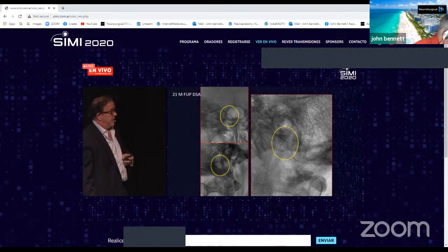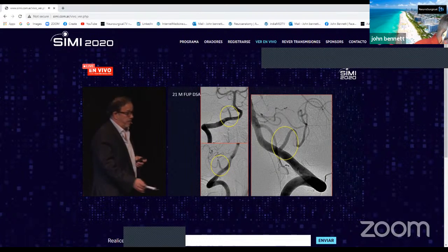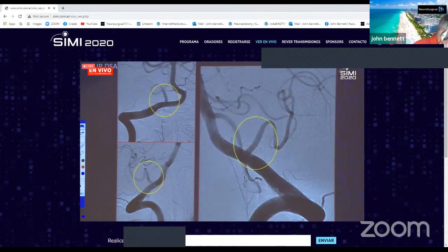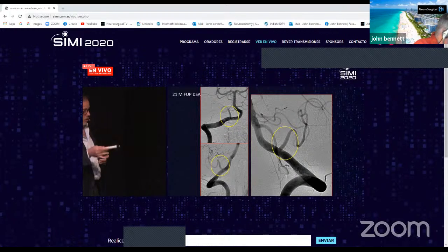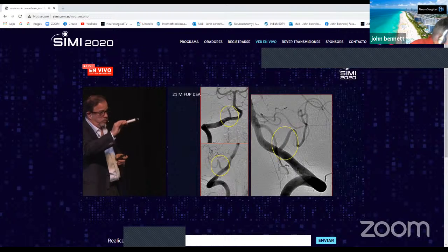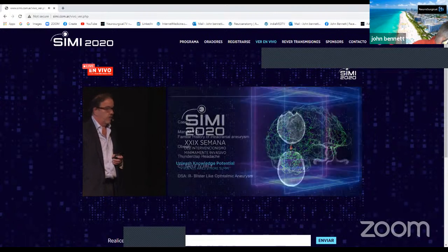los 7 meses. Ese es a los 21 meses una angiografía por sustracción digital, donde se ve perfectamente cómo está ya perfectamente circulada la PICA con el Pipeline colocado, el diversor de flujo, con la reconstrucción perfecta de la arteria, la vertebral permeable, y cómo se logró poder colocarlo con absoluta precisión hasta el ras, hasta el origen mismo de la arteria PICA de ese lado.